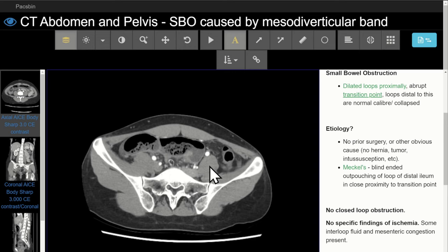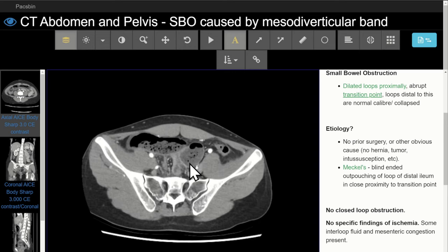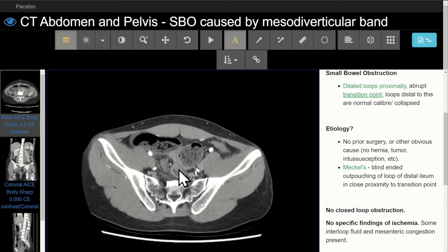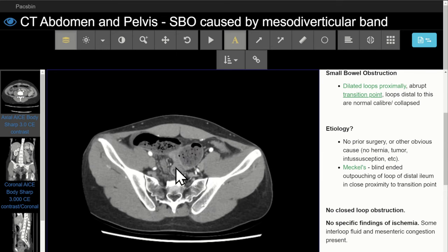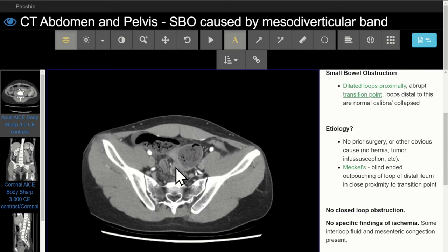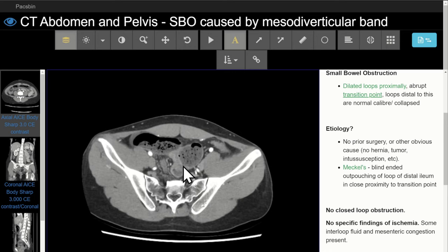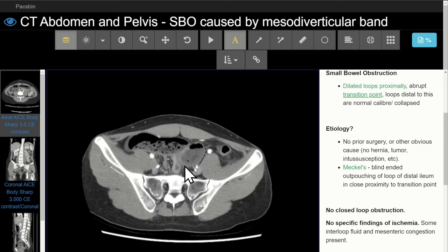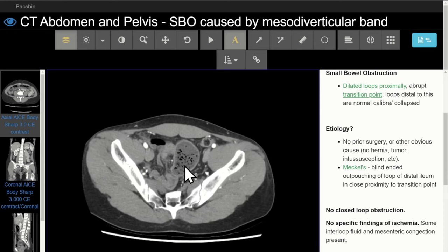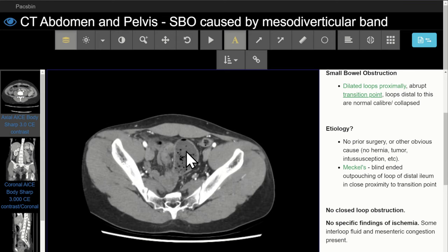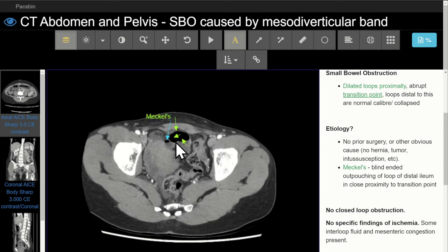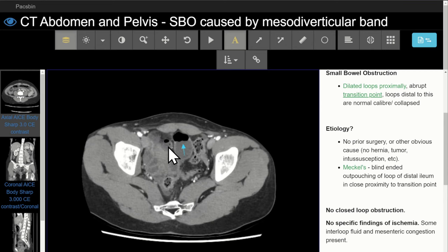Second, what is the cause of this bowel obstruction? We don't see any obvious cause at first at the transition point — there's no mass, no hernia, no intussusception. There is abrupt angulation at the site of obstruction, but there's no history of any surgery or any other reason this patient would have adhesions. So looking more closely, there is actually a blind-ended outpouching from the loop of bowel just proximal to the site of obstruction. That is a Meckel's diverticulum.